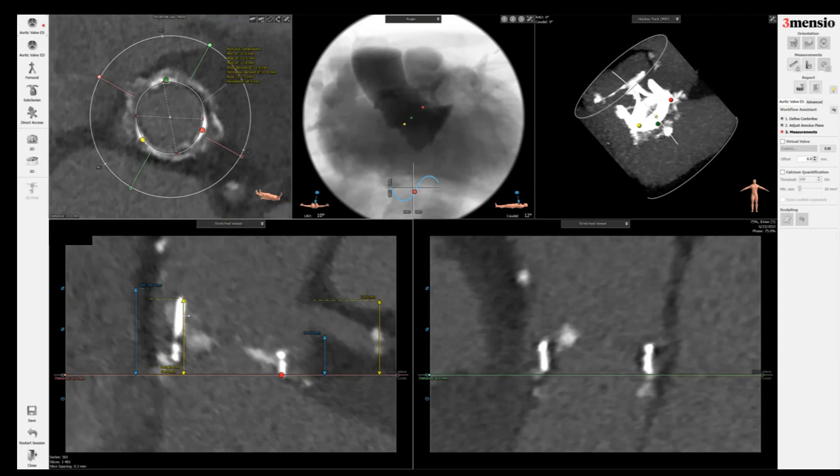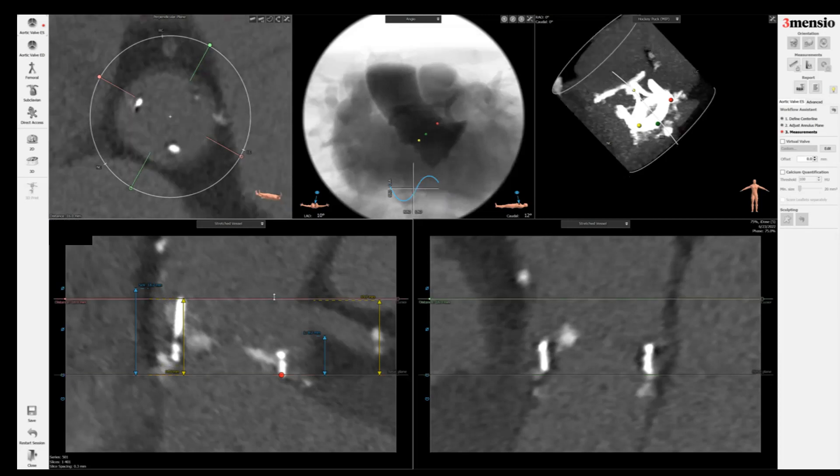With bovine pericardial valves such as this one, Mitroflow or Trifecta, the top of the stent frame is going to be roughly where the top of the surgical valve leaflet will sit. But if it's a porcine valve like the Hancock II, Mosaic, or Epic or Biocor, you're going to be lower than the top. Even then, we still go for the top of the surgical valve frame as the most conservative measure for coronary obstruction risk.